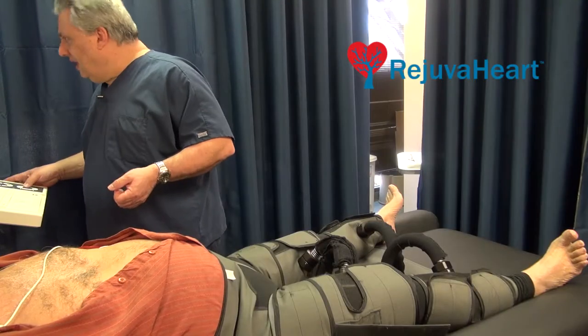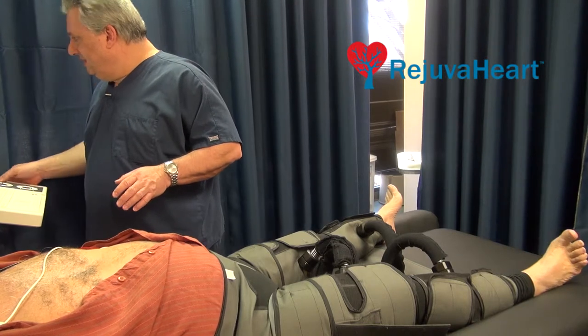As a matter of fact, a recent article just came out that too much exercise and too much vigorous exercise is more detrimental to your health. Whereas the Rejuva Heart is done in a relaxed state.